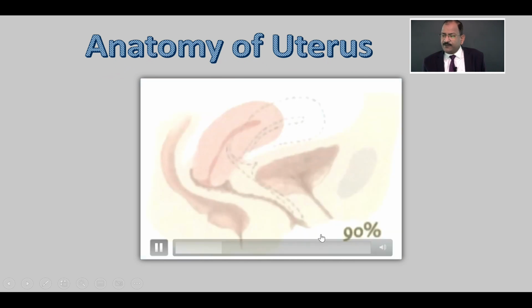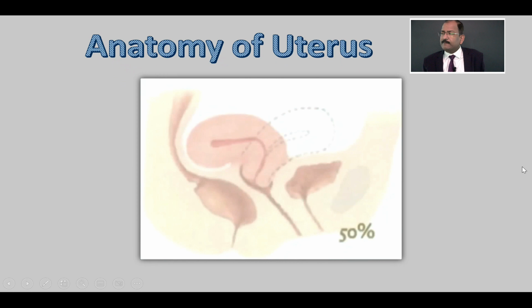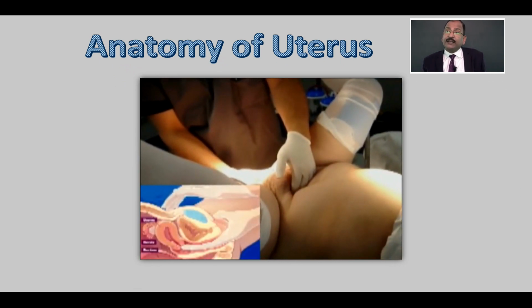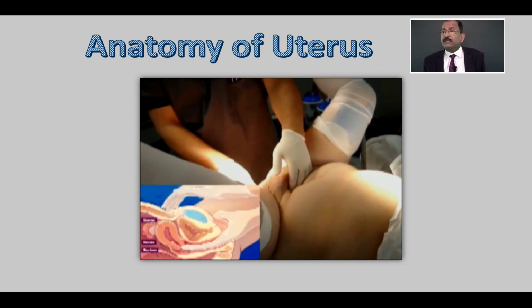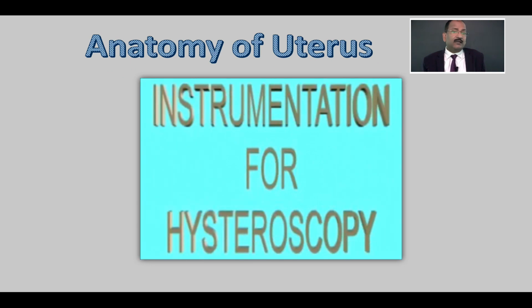So this is 90%. And after that, slowly it started getting retroverted. This is retroverted. But retroversion is not a pathology, but your entry technique will be different. That's why if you are doing hysteroscopy under laparoscopic guidance, you have a lot of idea of where to enter.